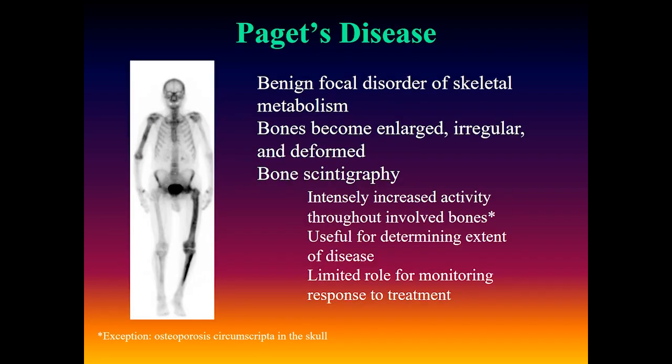Paget's disease is a benign focal disorder of skeletal metabolism. The bones become enlarged, irregular, and deformed. On bone scintigraphy, the involved bones are characterized by intensely increased uptake. The bone scan is useful for determining the extent of disease, but has a limited role for monitoring treatment response. The one exception to the intensely increased activity is osteoporosis circumscripta in the skull, which presents as an area of decreased uptake.